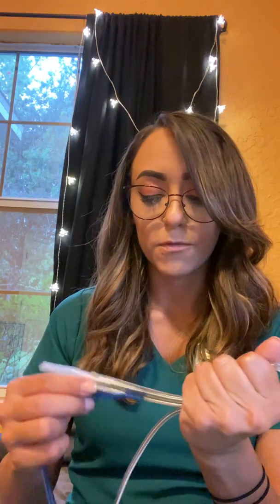The first thing we can do is demonstration of the gastric contents. The tube is in place and we're going to take the end of the tubing before it gets to the pigtail and clamp it. We'll attach a piston syringe, unclamp it, and aspirate a bit of content. We're going to look for the color — probably green or brown — and then place the aspirant onto a pH paper. It should be between about one and four if it's stomach contents, and the strip will read about one to eleven. As long as it's within the right pH range, that gives us confirmation we've aspirated gastric contents, meaning we are in fact in the stomach.